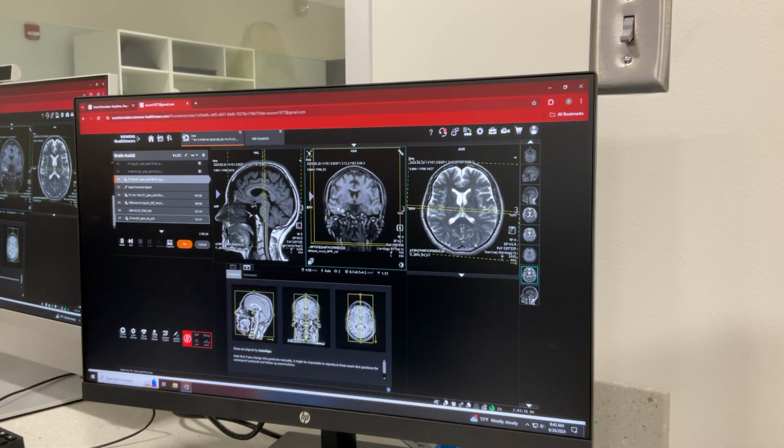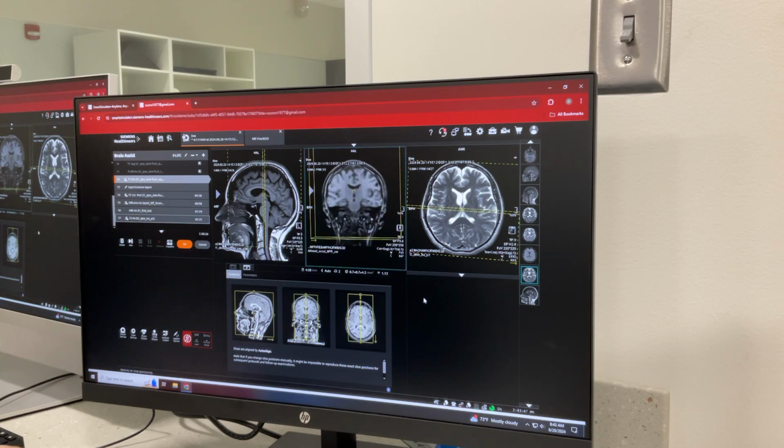I think it just automatically populates these three. That's what's good. You're gonna drop it. Good enough for me. Yep, you have to go back to your original and grab it again. Yeah, you can use the mouse. Drop it right there. The third picture?